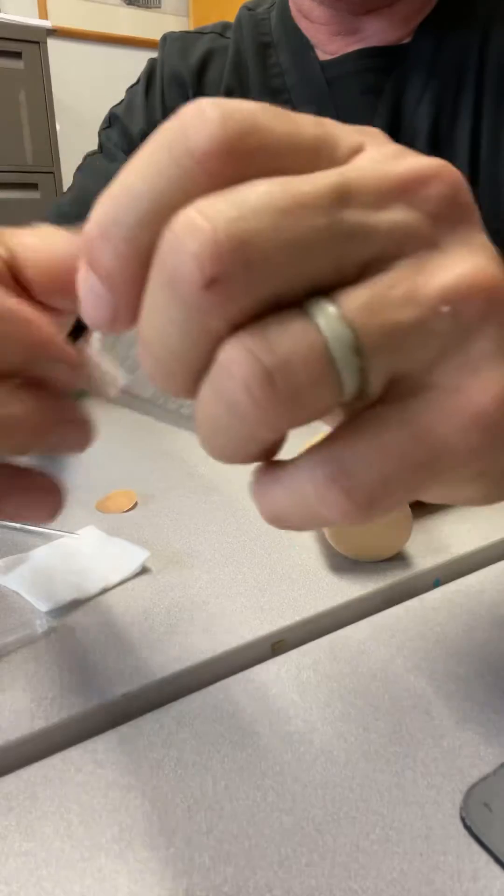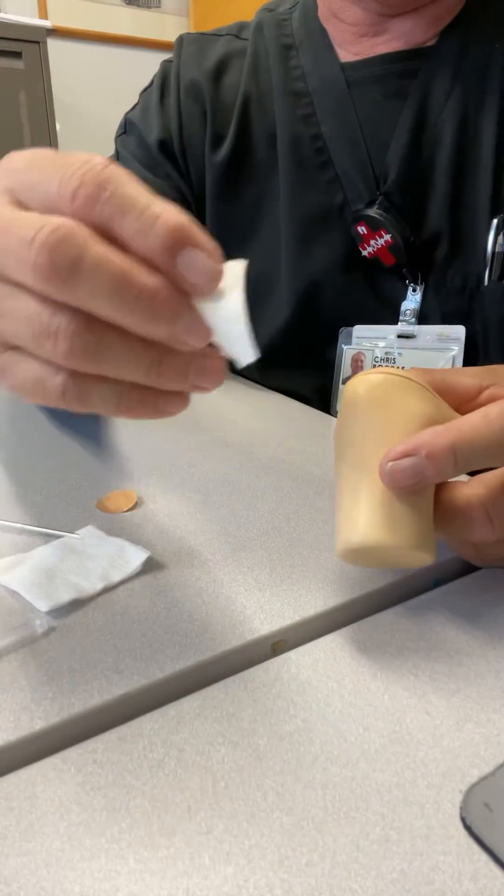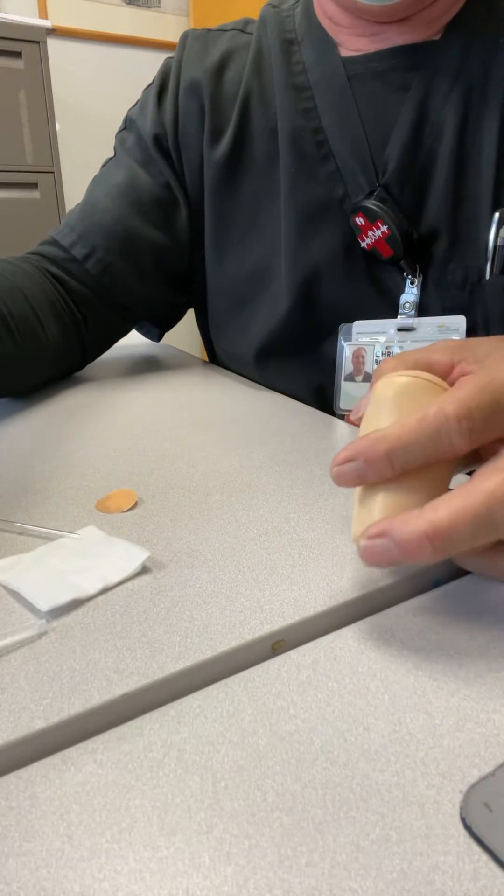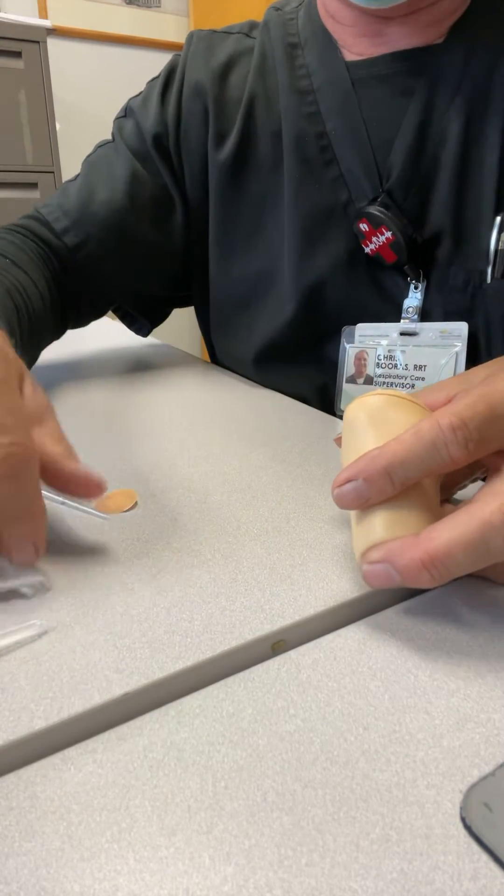You want to get your alcohol swab, go to the lateral side of the heel — the outer edge — and then wipe it with a 2x2 after you wipe it with alcohol.